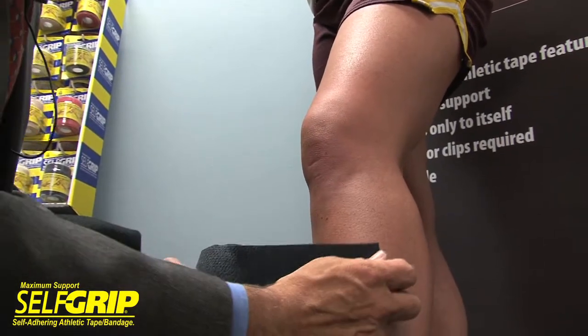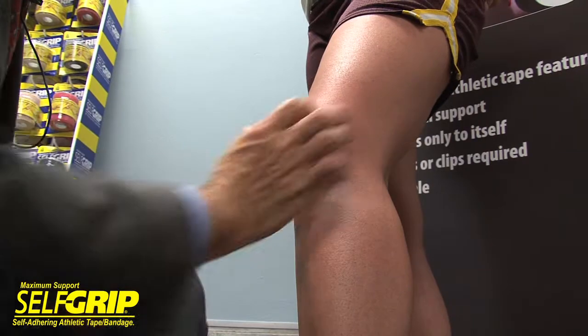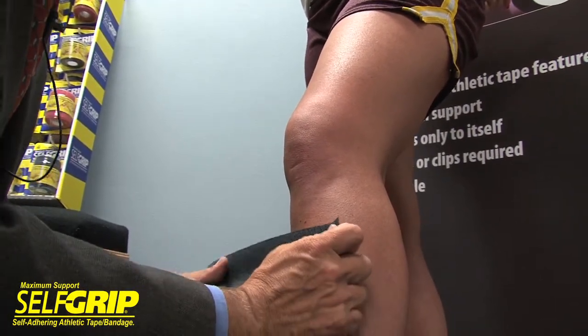Now we're going to do the knee. We're going to start mid-calf and work our way up to the thigh. We want to keep a little space in the kneecap so it's comfortable for the athlete.